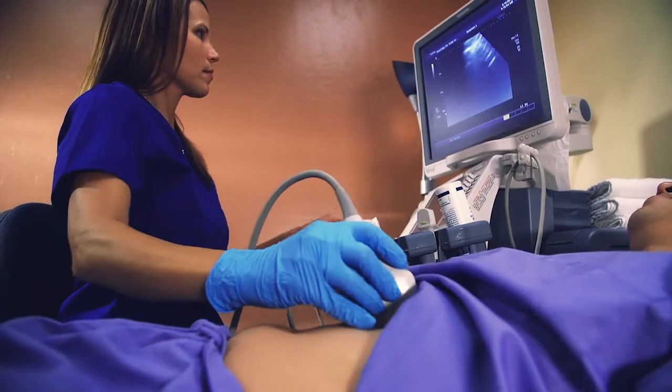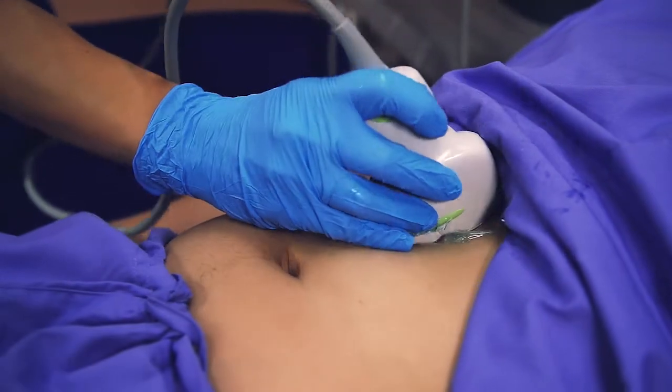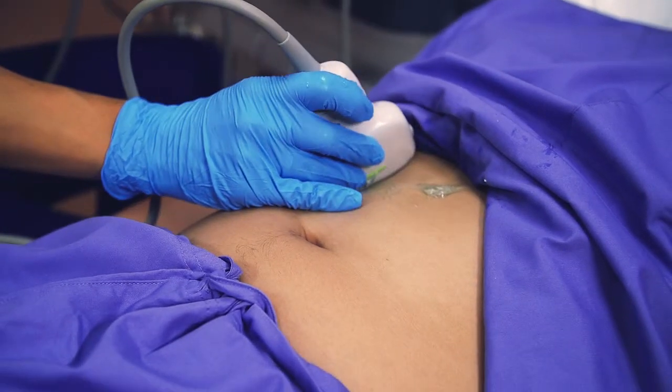which is a small probe resembling a bar of soap. The sonographer then gently passes the transducer over the skin of the area being examined, producing a sensation of light pressure.